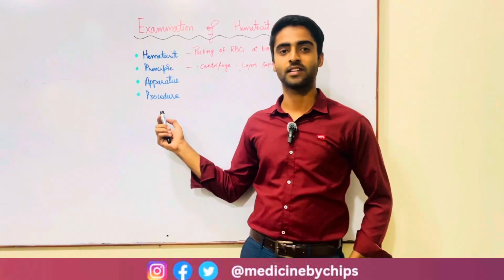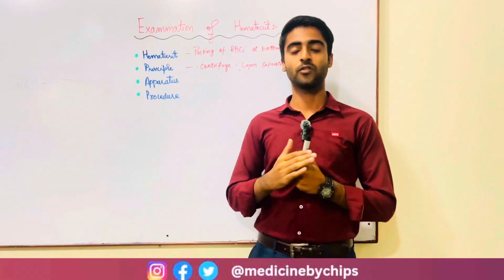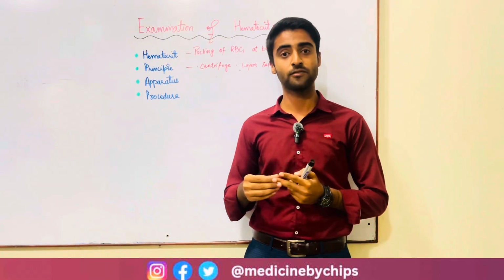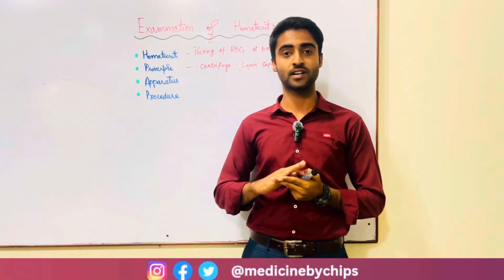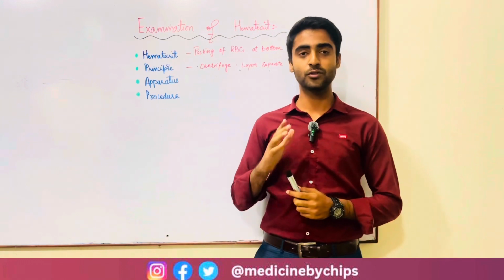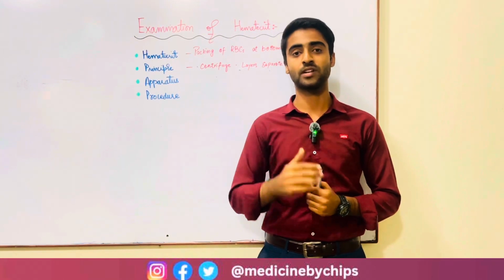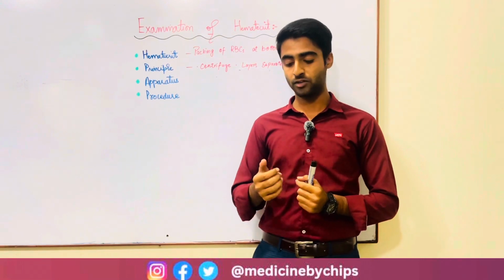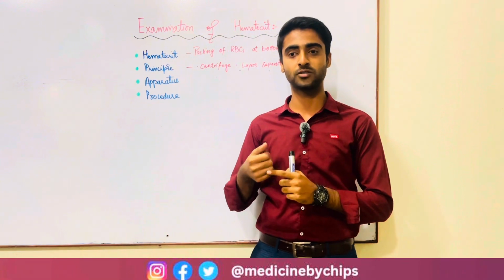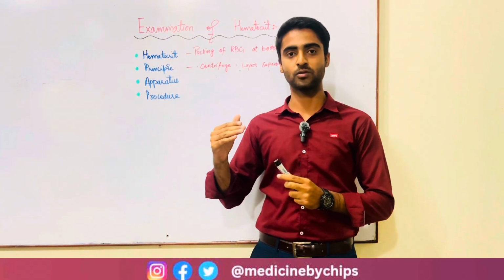Now I will explain the procedure of the examination of hematocrit. First of all, we need a sterilized lancet, which is used to prick your finger, and the blood will come out. We discard the first blood and then take a heparinized capillary tube. One end of the capillary tube is marked, and it is known as the red band end. You place your finger on the opposite side of the red band so that the blood will flow into the capillary tube.